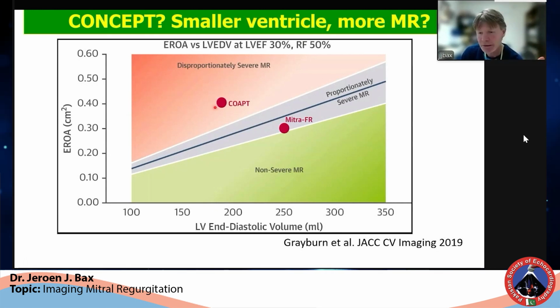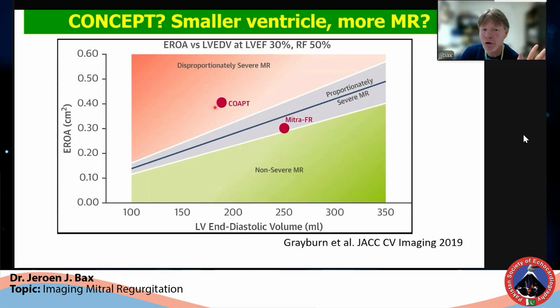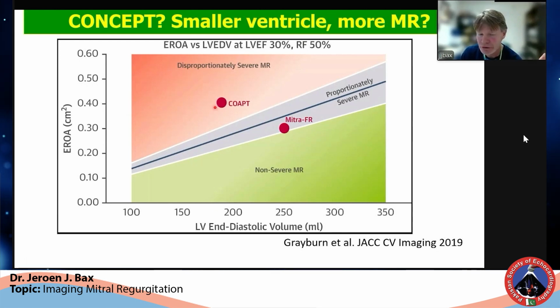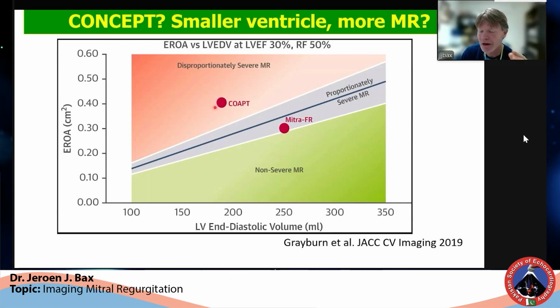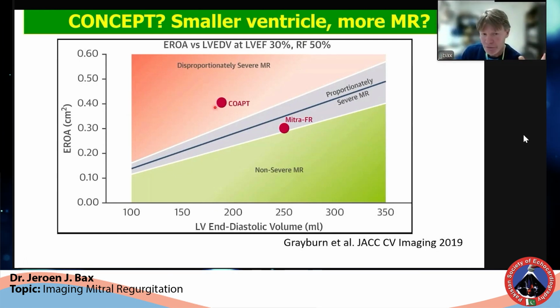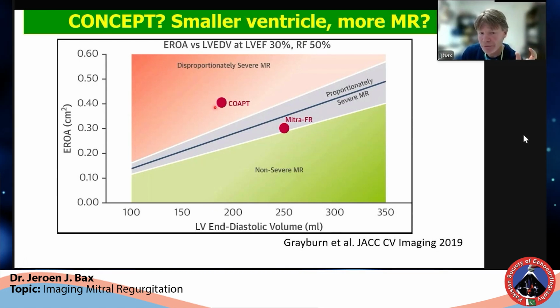We take the strain. If you take the strain of the left ventricle, and let's say that it is below 12-13%, you should not clip the mitral valve or do it surgically, because we've seen these cases also surgically, and if you repair them perfectly, the ventricle shows now really how bad the ejection fraction truly is. Because we had one case like that, where the ventricle was not doing more than this. So we repaired it. We did a perfect repair. It was a secondary MR, perfect repair.